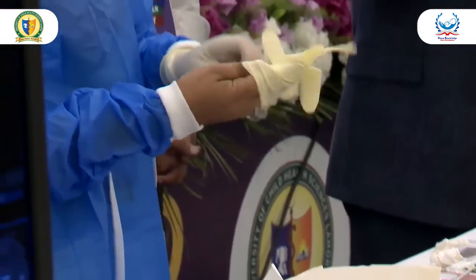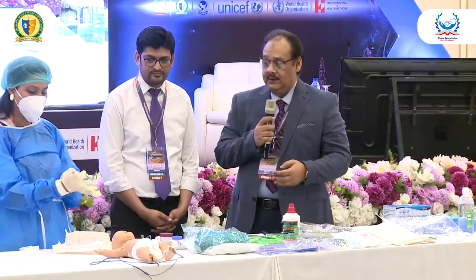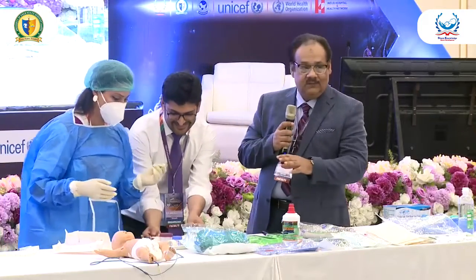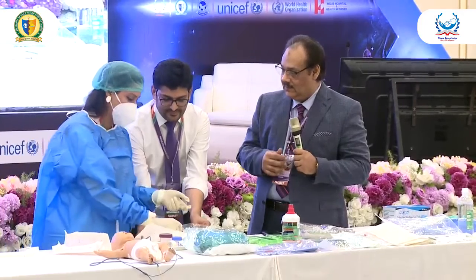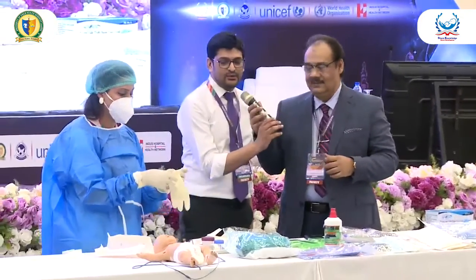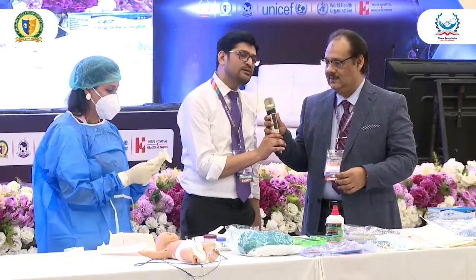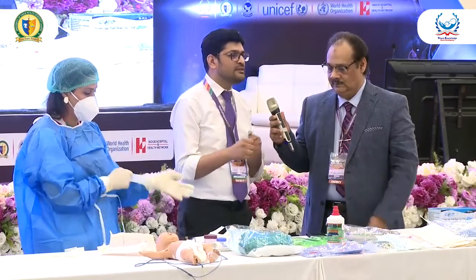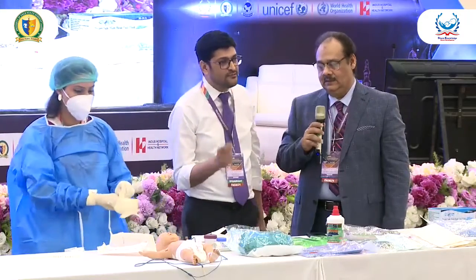Yeah, you have to use the insides of that, because both gloves are fine. Our sister is a little bit anxious, so don't worry about that. We are doing very good. Why are you putting on two gloves? We are about to put on two gloves as we are supposed to clean the site of insertion with povidone iodine. Once we have cleaned the site of insertion with povidone iodine, the first layer of our glove will be a little bit infectious, so we are supposed to remove that first layer.